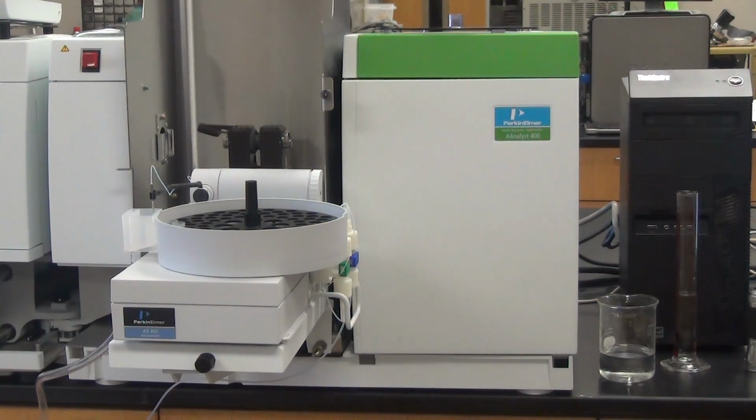The only place they touch is right here at the back. So if you take this and slide, see where it goes from being big down? It's got a bevel. So you're going to clean right in there really good. That's where the tube touches. And then kind of clean that.